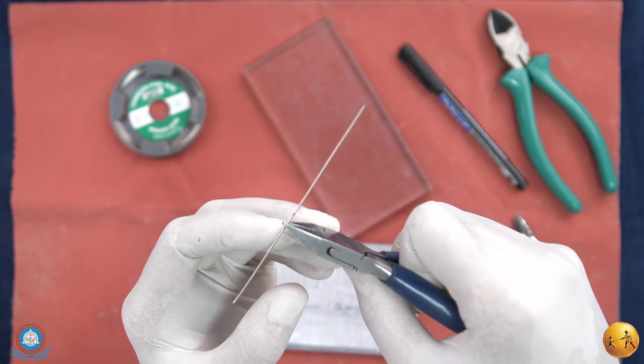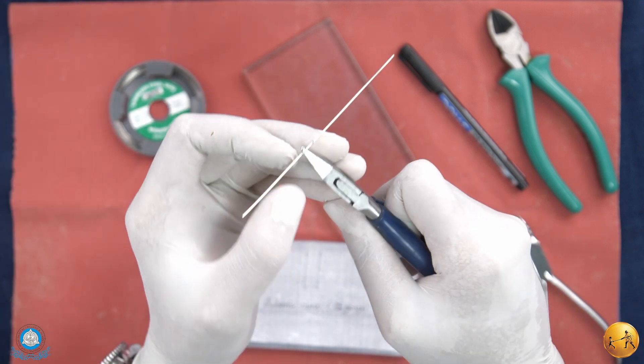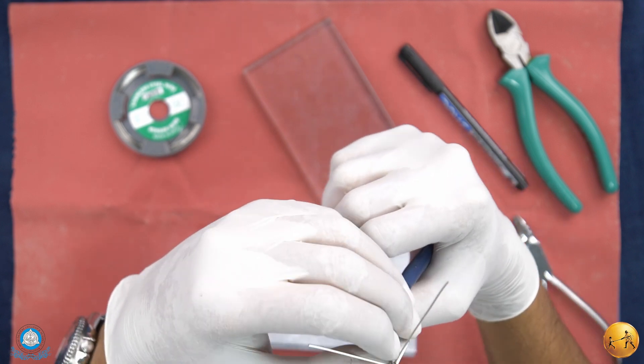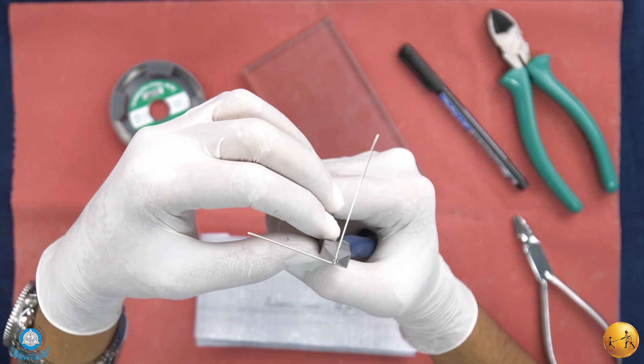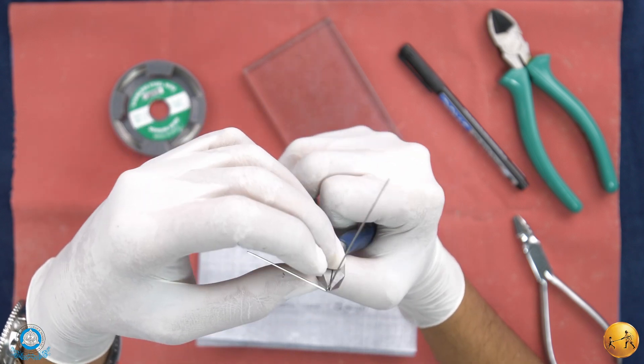I've marked two points, so I'll give two 90-degree bends — one on the right side and one on the left side at those marked points. This is the first 90-degree bend.